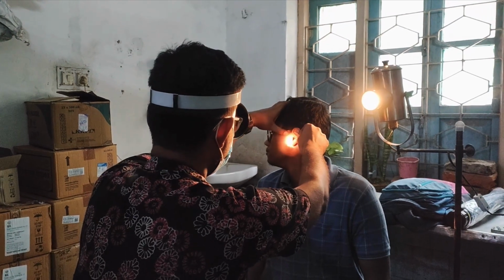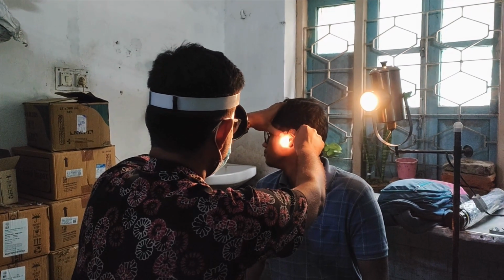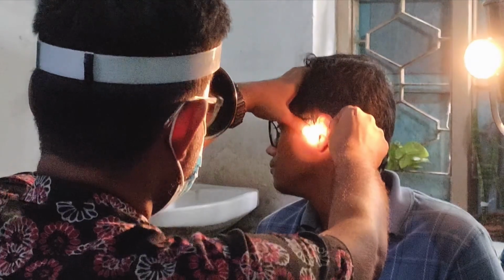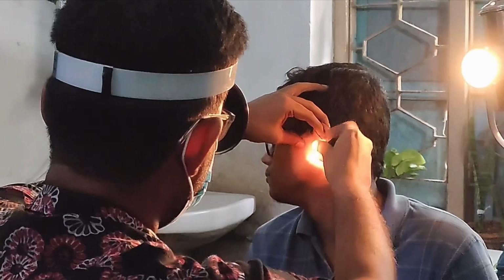Now again, the light from the bull's lamp has been reflected by the head mirror onto the external auditory canal of the patient, and I have pulled the pinna upwards, backwards and laterally to straighten the cartilaginous canal and align it with the bony canal so that I can see far inside and, if possible, even the tympanic membrane. That is how I am examining without a speculum.